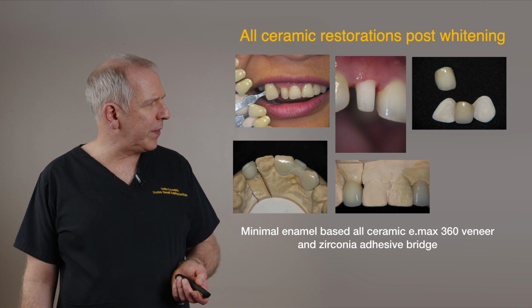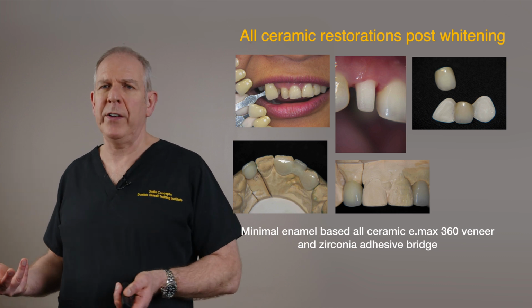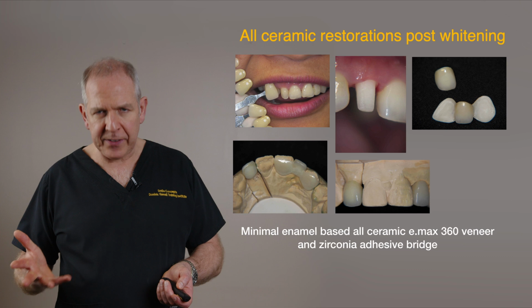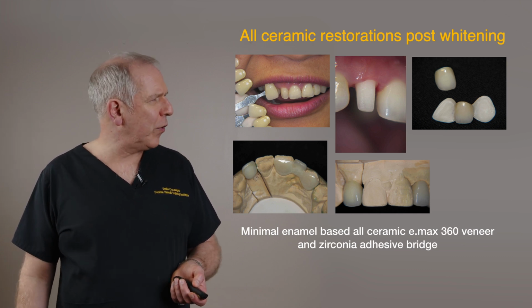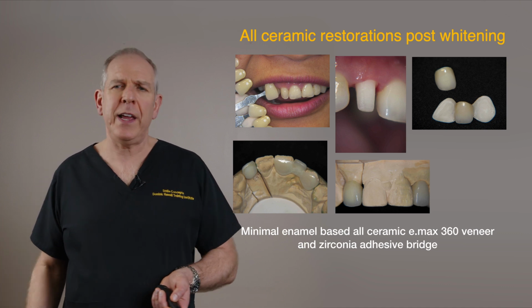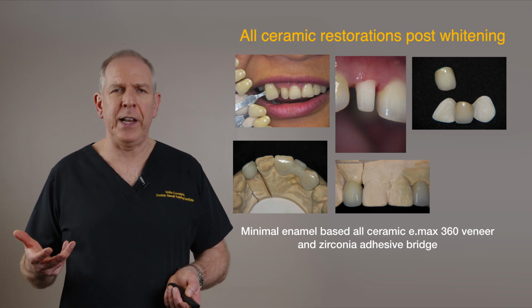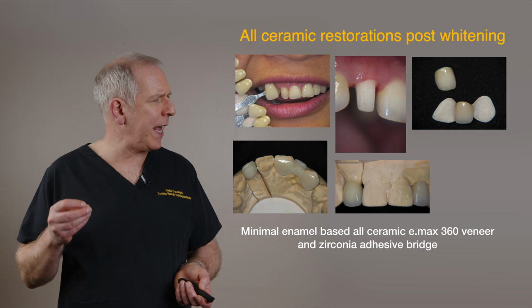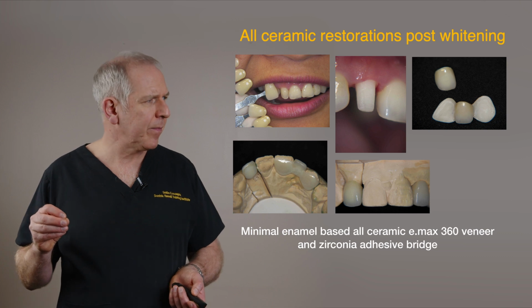So as with most of these cases, we are basically going to tooth whiten her first because she basically wants to just elevate the lightness of the teeth. And there you can see on the lateral, we could have done this in composite, we did this in ceramic, and you can see a very minimal all ceramic preparation still in enamel. And that allows us to deliver a highly aesthetic Emax restoration for her.